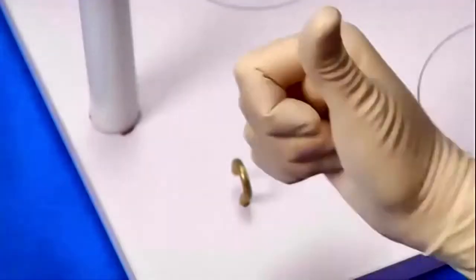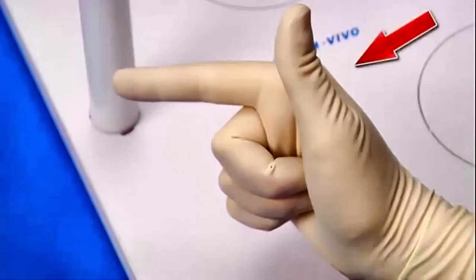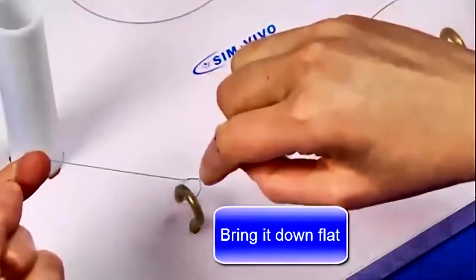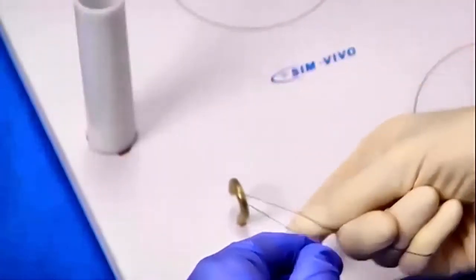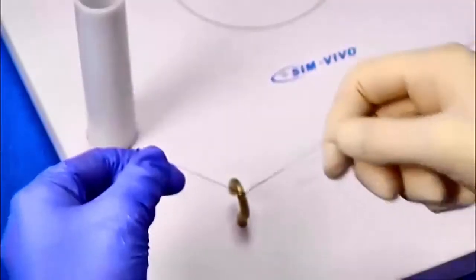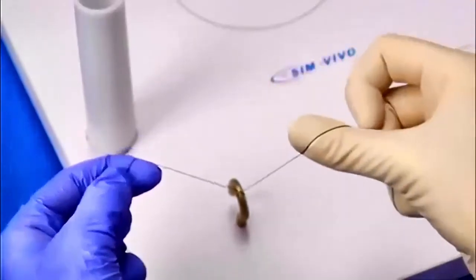For two-handed ties, you will use your thumb and index fingers as posts about which you will create loops for your throws. You can begin by either using your thumb or your index finger as a post for the first throw, but let's start by using your thumb. Remember, the goal of the first throw is to bring it down flat. To avoid crossing your hands as the throw is coming down, we would suggest that you cross the suture ends before starting. So cross the ends so your active hand has the one on the bottom.